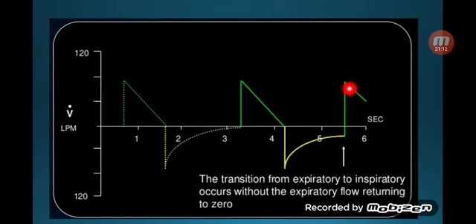And you'll end up needing higher pressures to keep ventilating, which means barotrauma. And because of the autopeep being a lot of volume living in the lungs, you're also going to have volutrauma eventually. So you're harming the lung, and at some point it's going to be really difficult to ventilate the patient, and it can affect the hemodynamics as well. And that's also a big discussion for later.